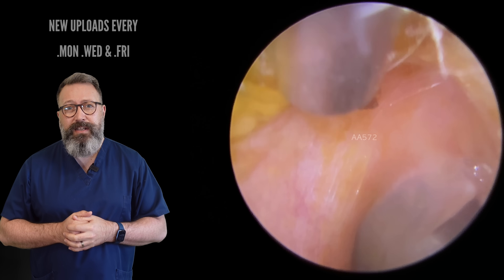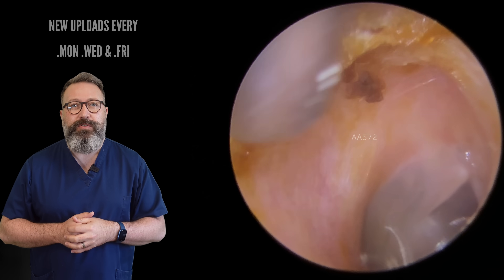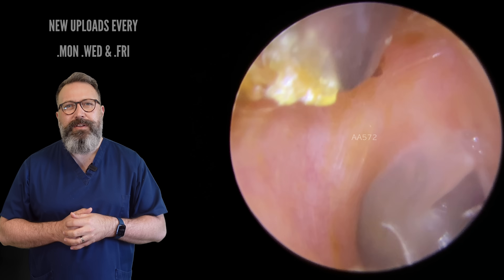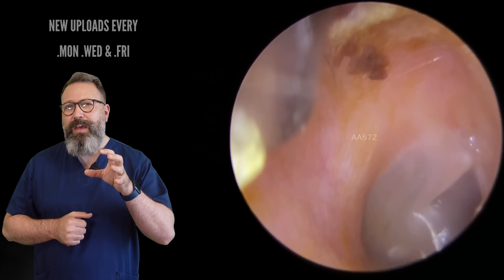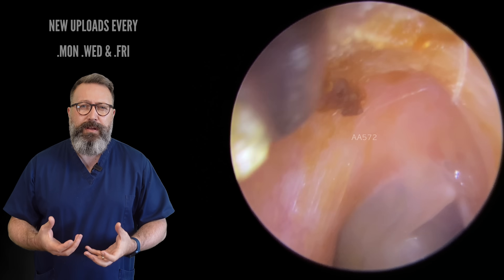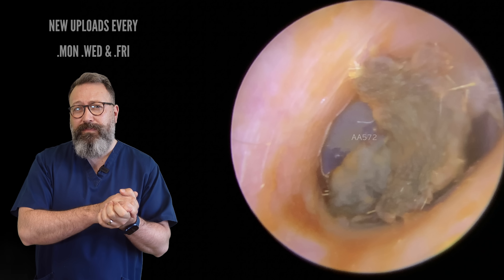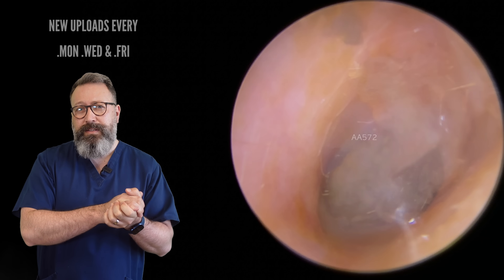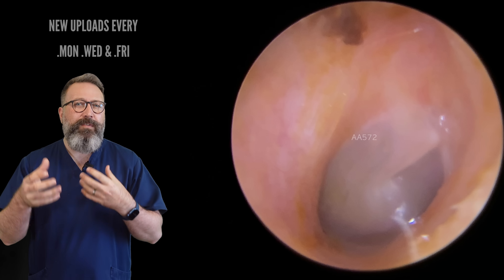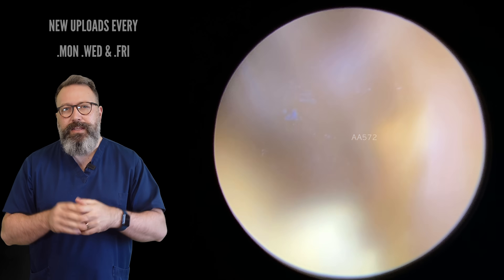Just going to tidy up this little bit of dry skin around the outside edge as well. I'll put it onto the rulers for you later so you can see exactly what came out. Now, one thing this patient did have was a lot of dryness to the ear canal walls. We talk about producing oil on the outer part of the ear canal which softens the wax up — this patient is obviously not producing a tremendous amount. So this is what it looked like before and this is what it looks like after — quite a big difference. I've advised this patient to use a little bit of olive oil to keep that ear canal wall skin really nice and healthy.